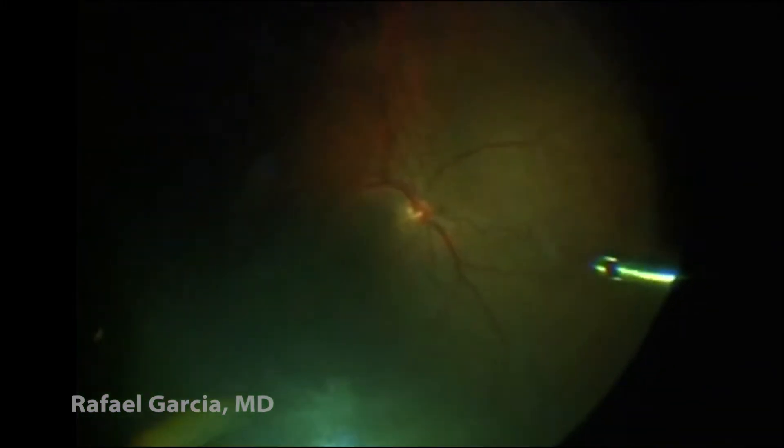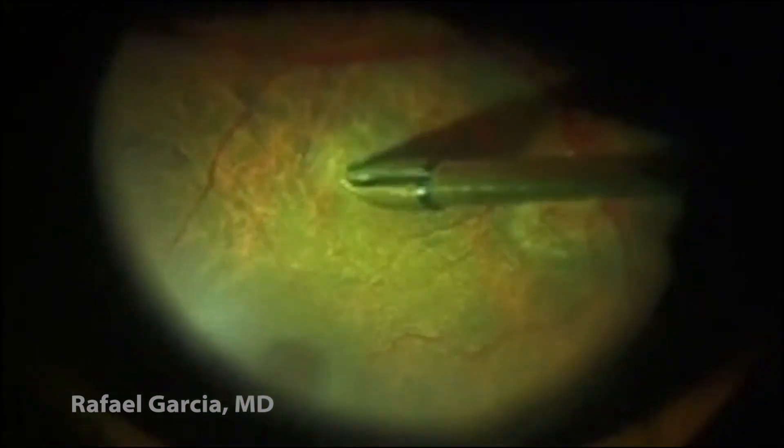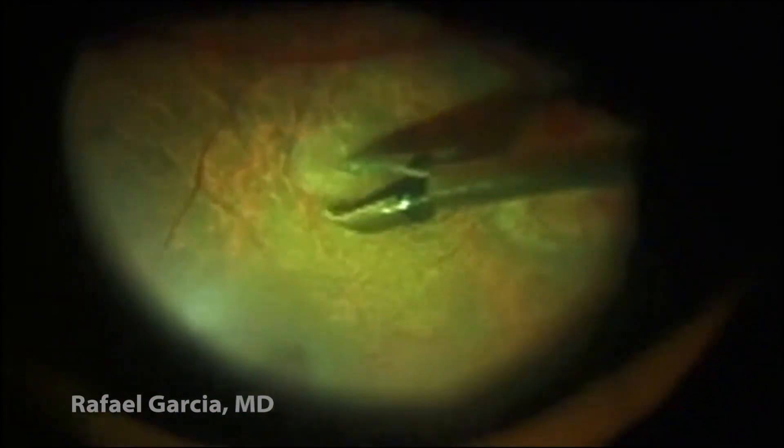Once a complete PVD is achieved, brilliant blue dye is injected to improve the visualization of the ILM. We can notice that there's an epiretinal membrane covering the macula, since it does not stain with the brilliant blue dye.